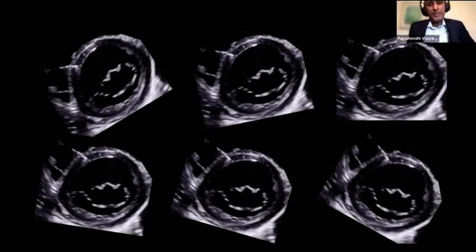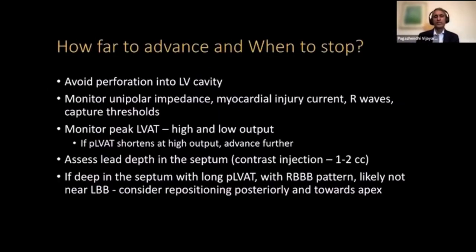Some patients may have pectus excavatum, the heart is even more rotated, or just by RV enlargement. So at least in my mind, I try to imagine why is my lead not penetrating the septum. So I try to orient the sheath slightly differently, go from keeping it at the neutral position of the C315 sheath, go more counterclockwise, further counterclockwise, or then I stop all of that and come back and go a little bit clockwise and see if that will get me into the septum, if the heart is rotated in another way.